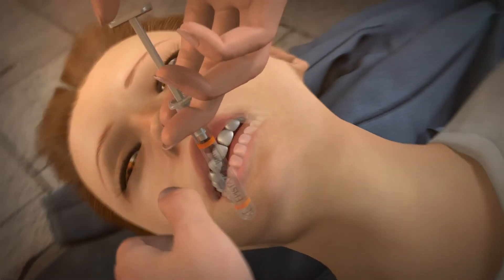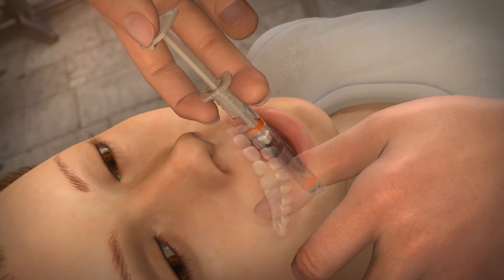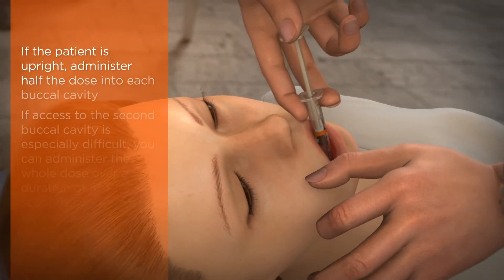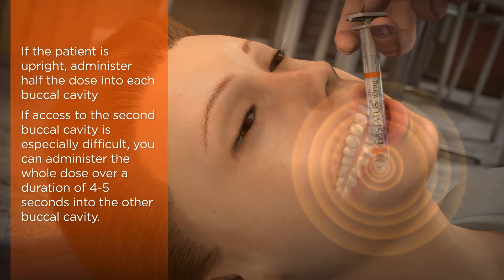Do not put the syringe between the teeth. Push the plunger slowly and drip into the mouth. Approximately half the dose should be placed into each buccal cavity. If access to a cheek is restricted, administer the full dose into the available buccal cavity.